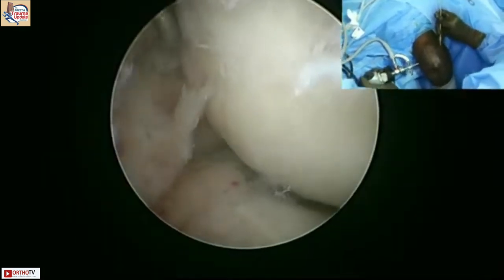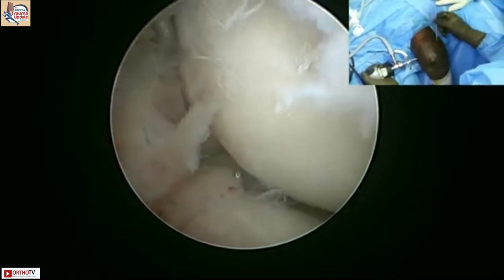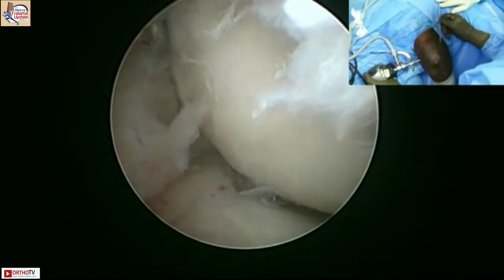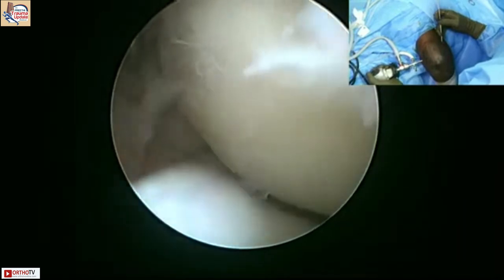So my portal is a little anterior because that was not the idea. So if I have to do ECRB, you have to come on it and then keep eating it and go back. So you have to come from here and then go out.